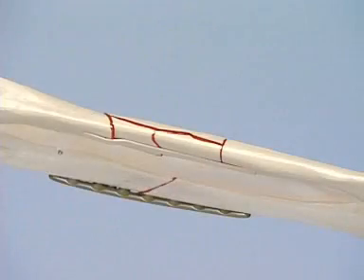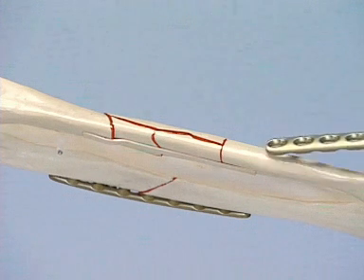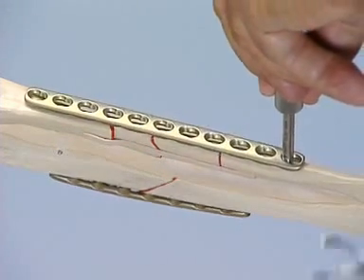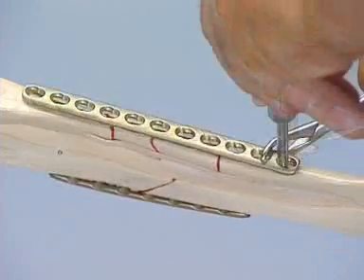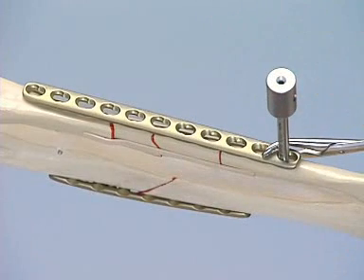Because of the interosseous membrane between the radius and the ulna, an approximate reduction of the length and alignment of the ulna will have taken place during the fixation of the simpler radius fracture. As a rule, the plate does not have to be contoured to the straight shaft of the ulna. In the exercise, the plate is fixed to the distal main fragment with reduction forceps. In a clinical environment, the plate may be inserted subcutaneously with the help of the LCP drill sleeve, leaving the fracture area unexposed.